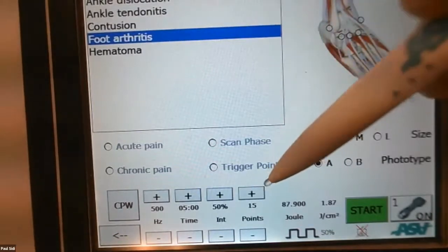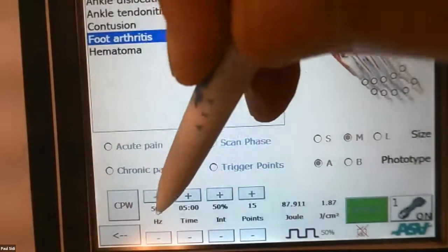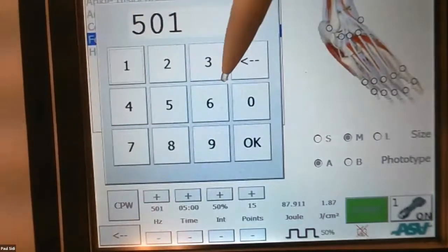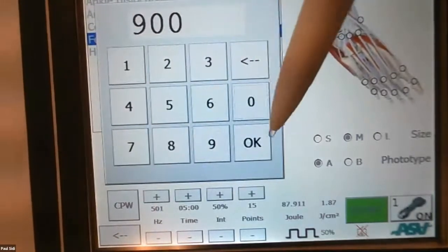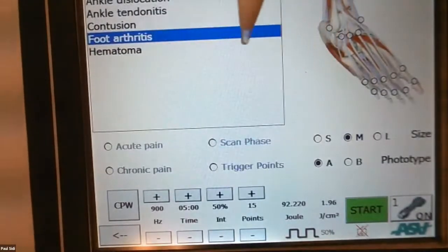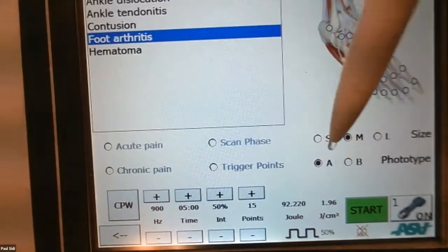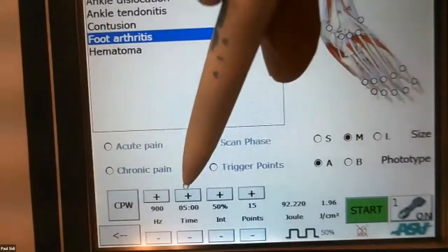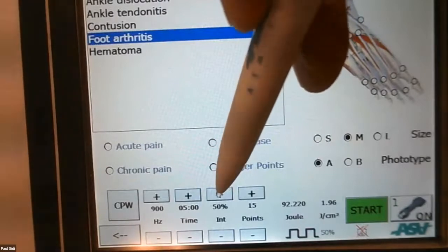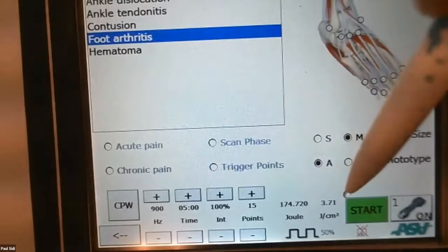I'm going to bring this right up, because it's a very chronic problem. So I'll press on there, and I'm going to go 900 hertz. And that will give a little bit more mechanical effect as well. That will have changed the joules I'm putting through there. I'm going to leave it 5 minutes. Because it's chronic, I'm going to go up to probably 100%. Now, 3.71 joules per square centimeter.